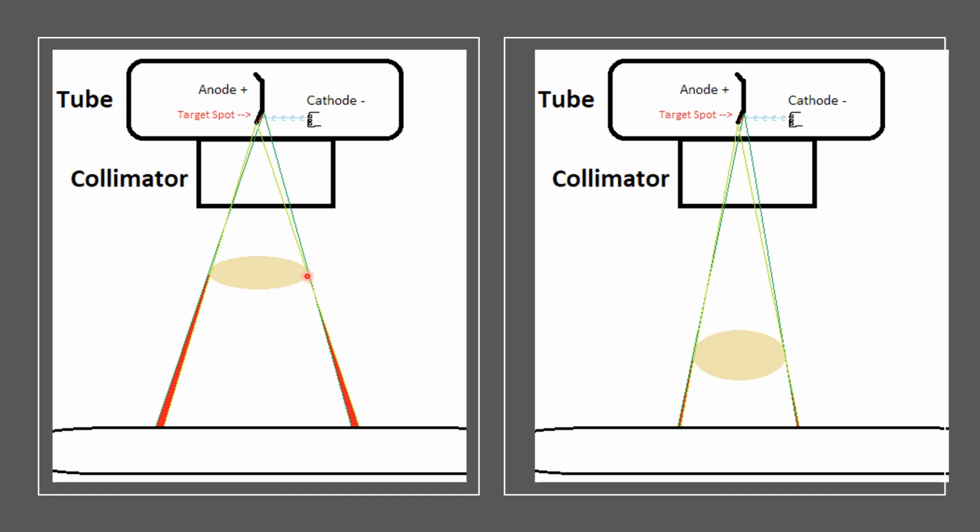The edge will catch here, in here for the 2, and the red is the amount of penumbra. Everything in between here to here is the umbra. So it's being represented as it truly is, in a straight line, straight down, and the penumbra is everything here.